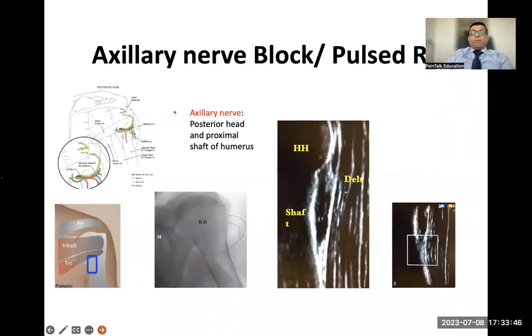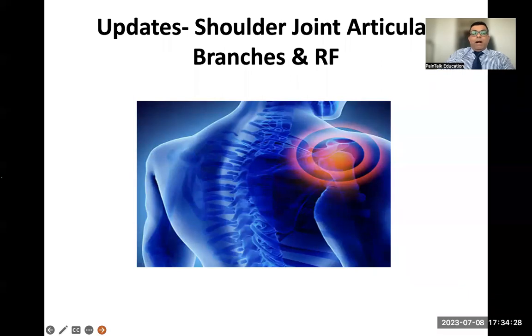The axillary nerve is now commonly targeted for postoperative analgesia and pulse radiofrequency of the shoulder joint. Place the ultrasound probe longitudinally at the back of the shoulder at the humeral head-shaft junction. Identify the deltoid and teres minor muscles, then use color Doppler to find the posterior circumflex humeral artery. Place the needle just on top of the artery to catch the axillary nerve, which accompanies the artery.